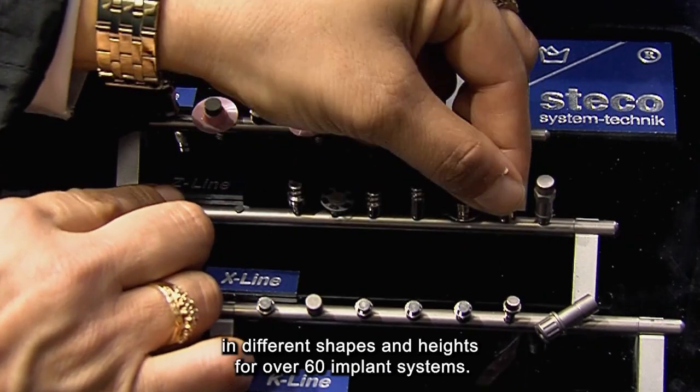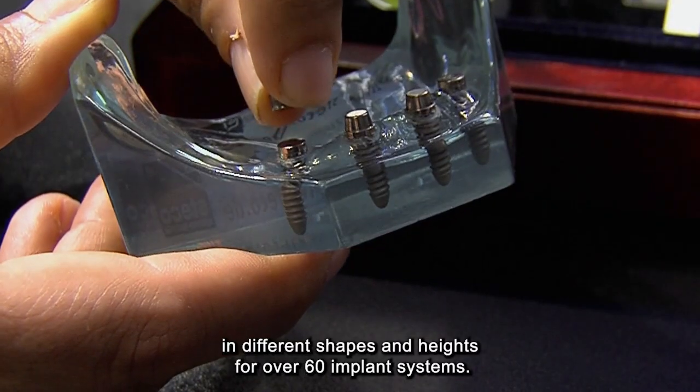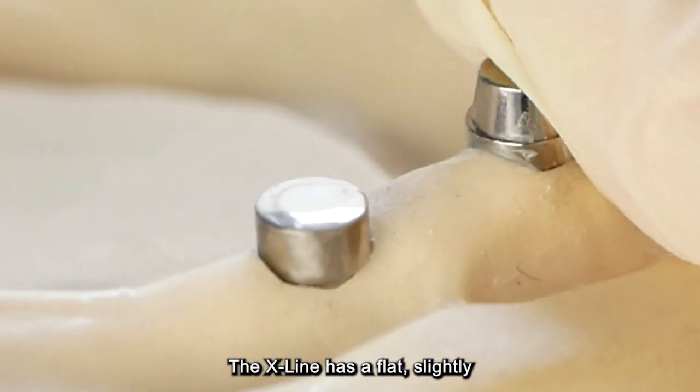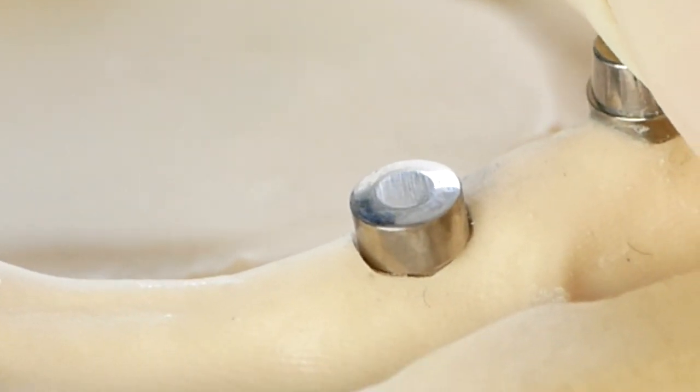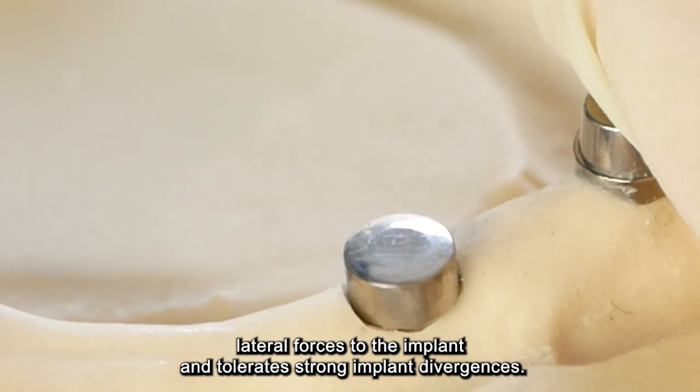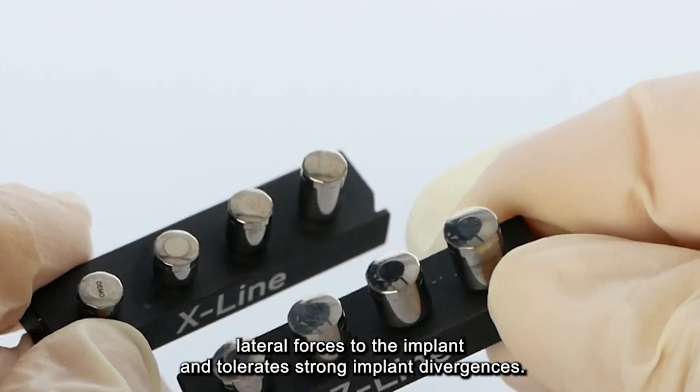Titan Magnetics are available in different shapes and heights for over 60 implant systems. The X-Line has a flat, slightly curved surface that allows self-centration of the denture. It doesn't introduce lateral forces into the implant and tolerates strong implant divergences.